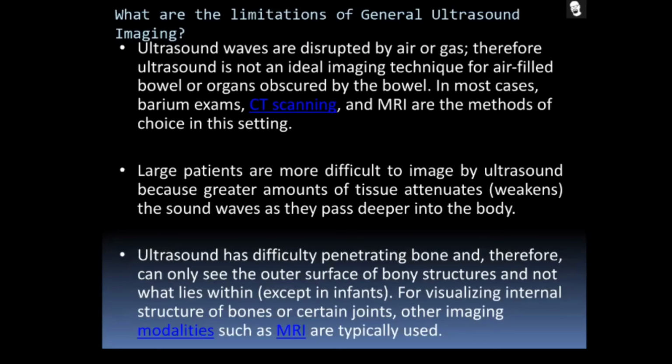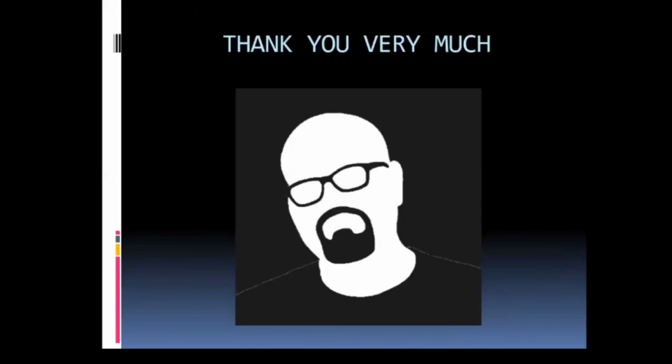But we can see what happened nearby, the tendons and ligaments in the border region. That is the bone-to-bone connection and the bone-to-muscle connection. We can predict whether the connection is made or not, and whether it has any inflammation. All of that we can predict, but we can't scan the internal part. That is what I'm mentioning. So I hope that's all about ultrasound.